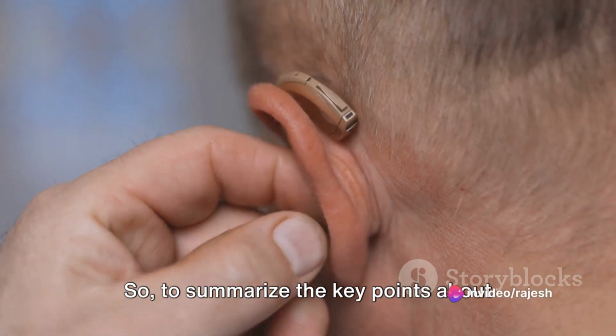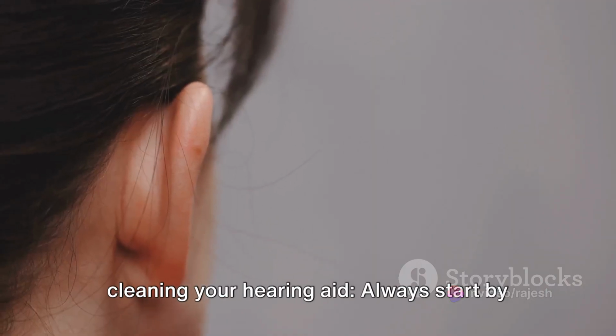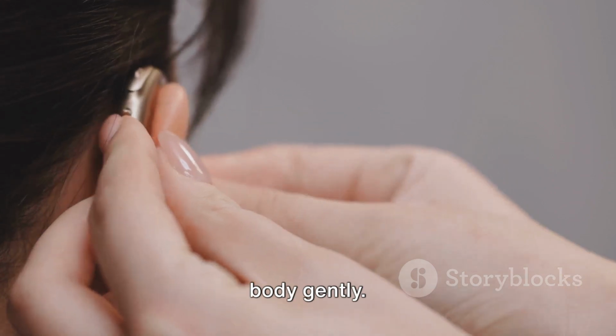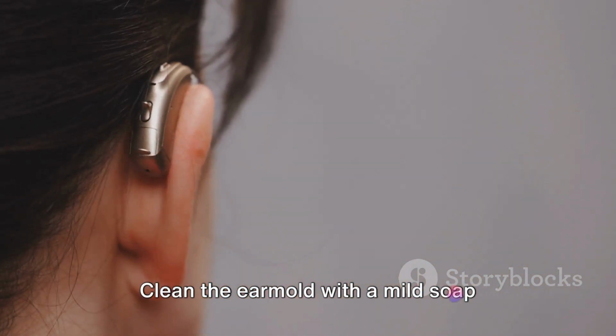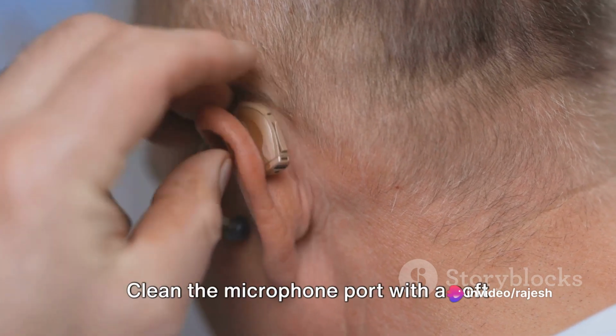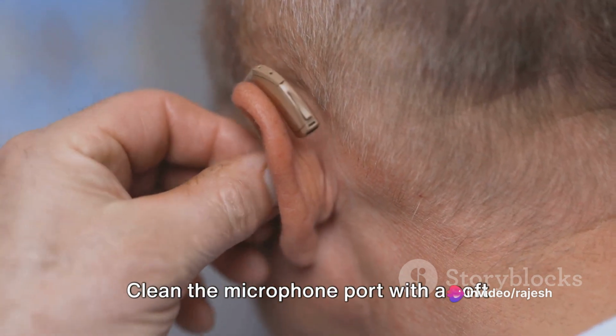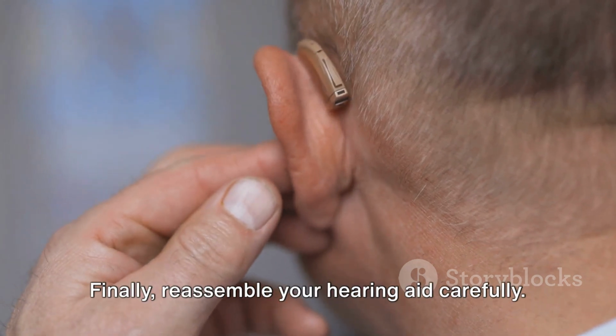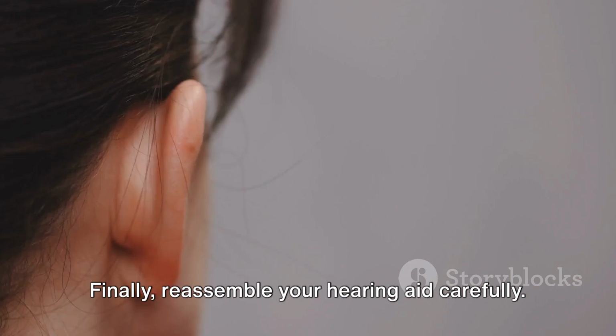So, to summarize the key points about cleaning your hearing aid, always start by washing your hands. Remove the ear mold from the hearing aid body gently. Clean the ear mold with a mild soap solution and a soft cloth, and let it air dry overnight. Clean the microphone port with a soft brush, and clean the battery compartment with a dry cotton swab. Finally, reassemble your hearing aid carefully.